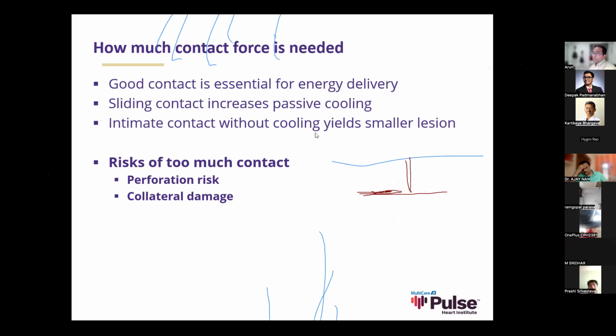Intimate contact without cooling leads to a smaller lesion. So you can't have too much contact either, because if it's dug into the tissue, then it will lead to loss of cooling effect, loss of irrigation, and that leads to a smaller lesion. So the risk of too much contact is perforation risk and collateral damage.